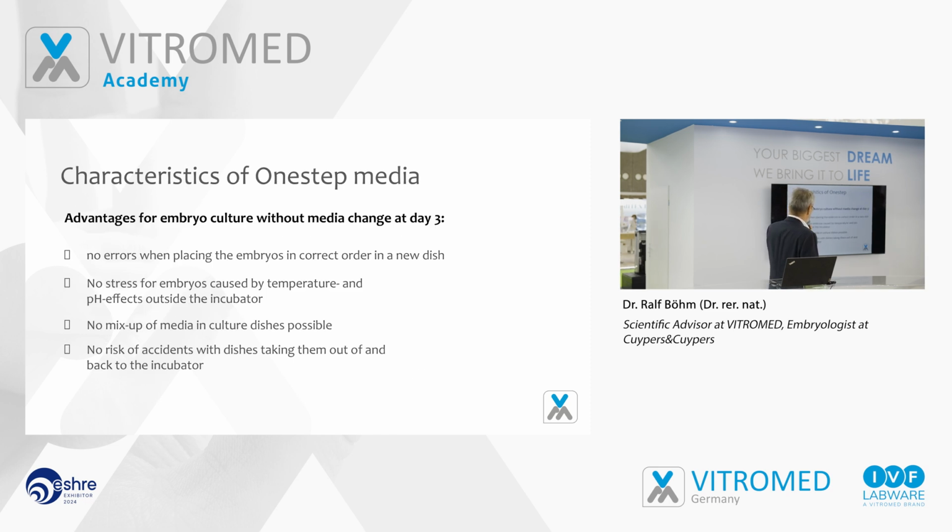The advantages of embryo culture without media change at day 3: you do not have errors when placing the embryos in correct order in a new dish. When you transfer them into a new dish and you do a single embryo culture, then sometimes it can happen that you mix up the embryos. There is no stress for embryos caused by temperature and pH effects outside the incubator, and no mix up of media and culture dishes is possible, because for the whole journey, it's just one medium. As well, there is no risk of accidents with dishes, taking them out and back to the incubator, because in the really worst case, it can happen that the dish will fall down, and then the whole thing is over.